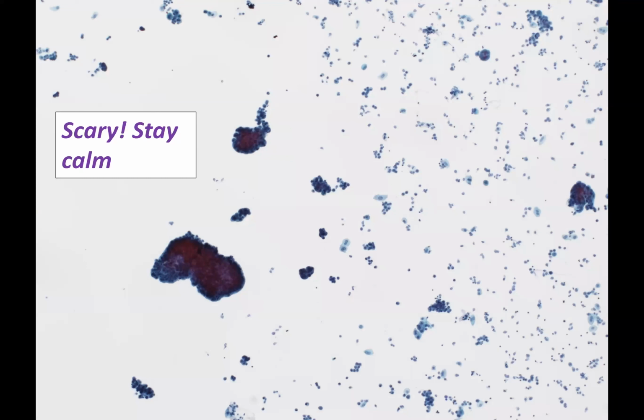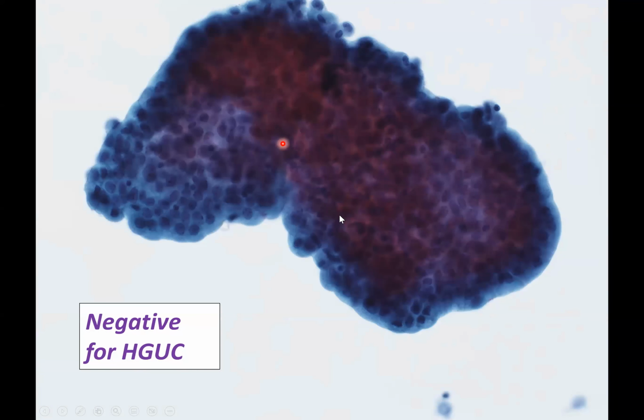And here's another instrumented sample with numerous very dark, thick, three-dimensional clusters. At high power, however, we can see that the nuclear to cytoplasmic ratio certainly here is not so high, and the cells have fairly regular, even chromatin. It's impossible to be sure if this is from a low-grade neoplasm, but it is negative for high-grade urothelial carcinoma. And in actual fact, this case also only had inflammation on biopsy.